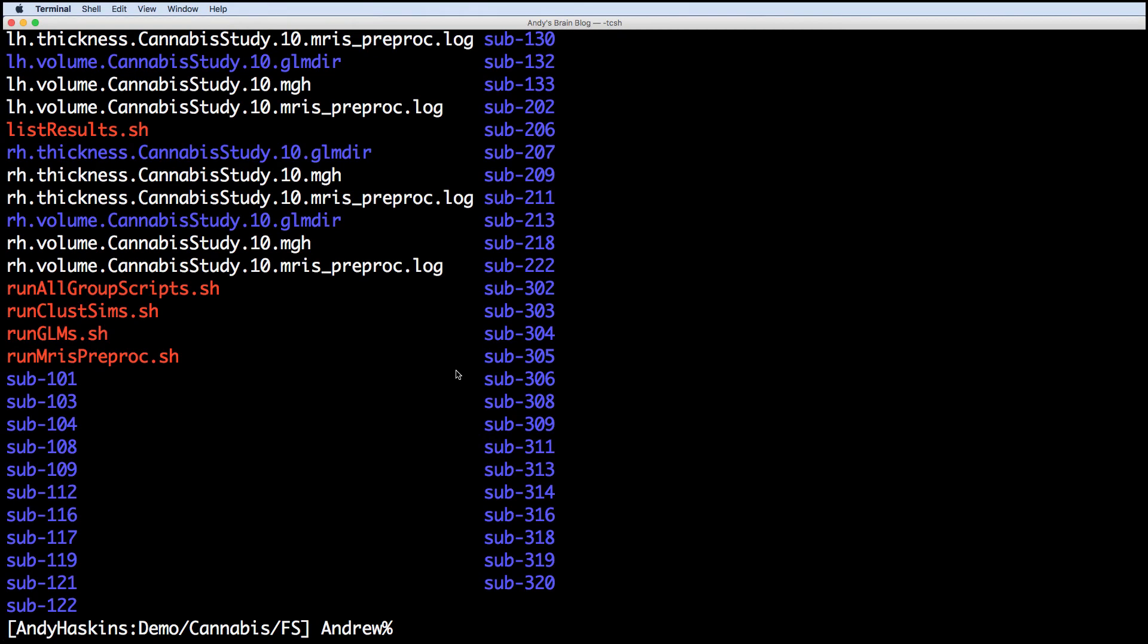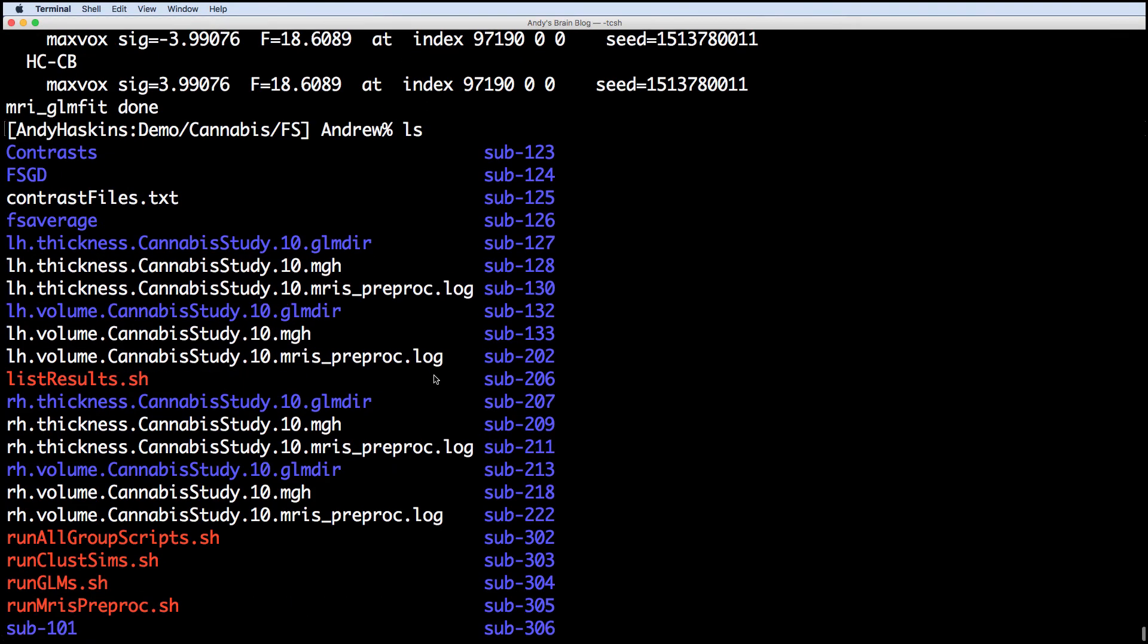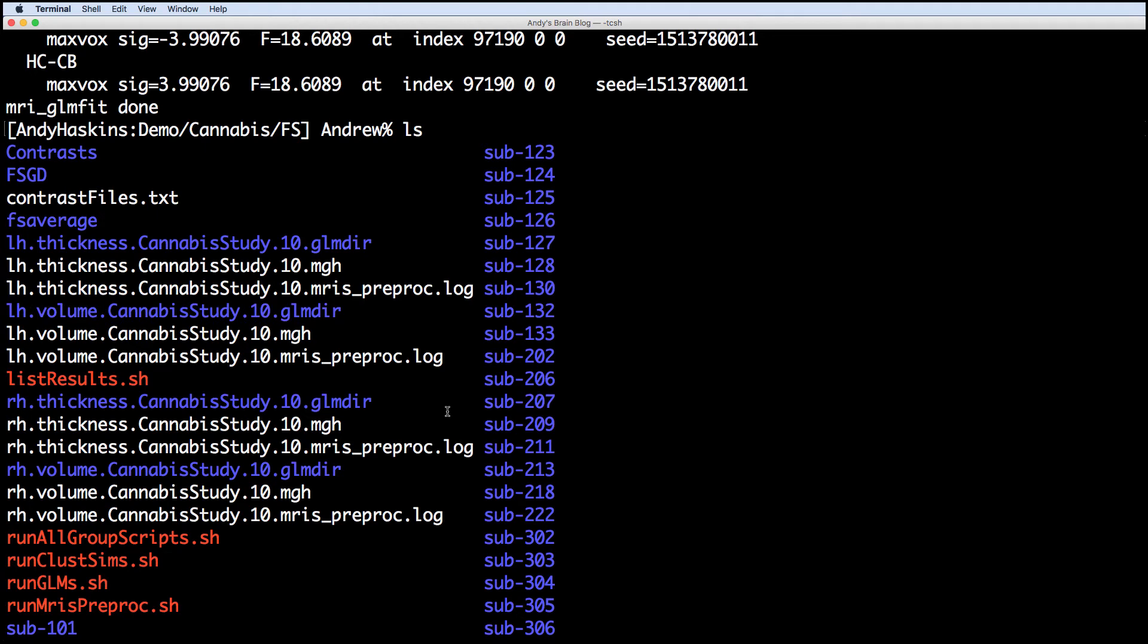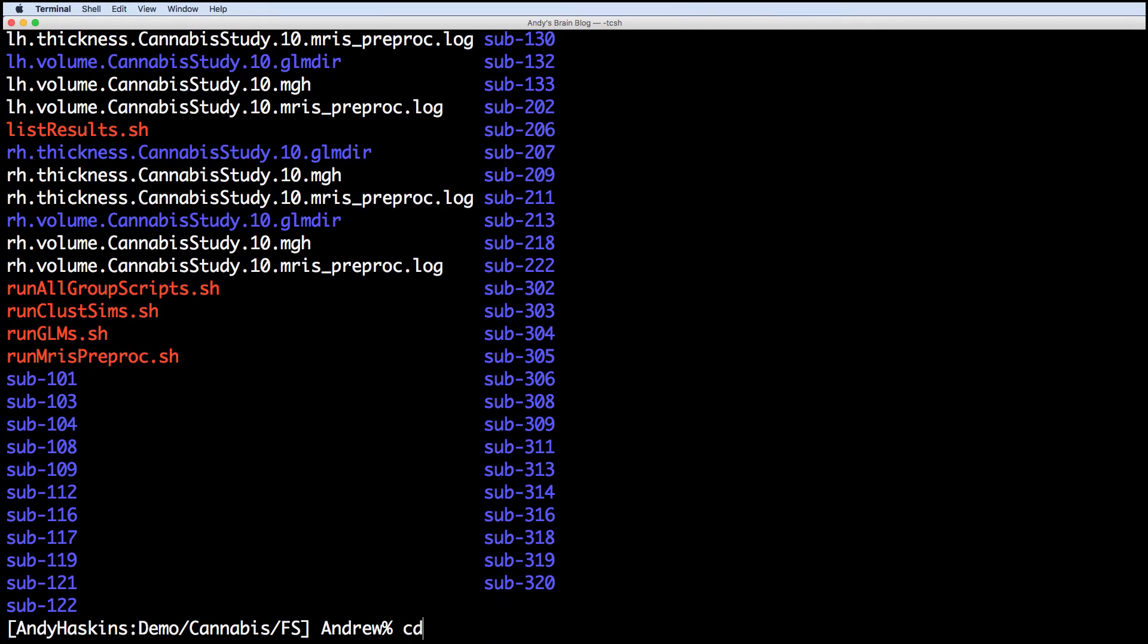This creates one output directory per hemisphere, per measurement. Navigate to the directory lhvolume cannabisstudy10.glmdir.